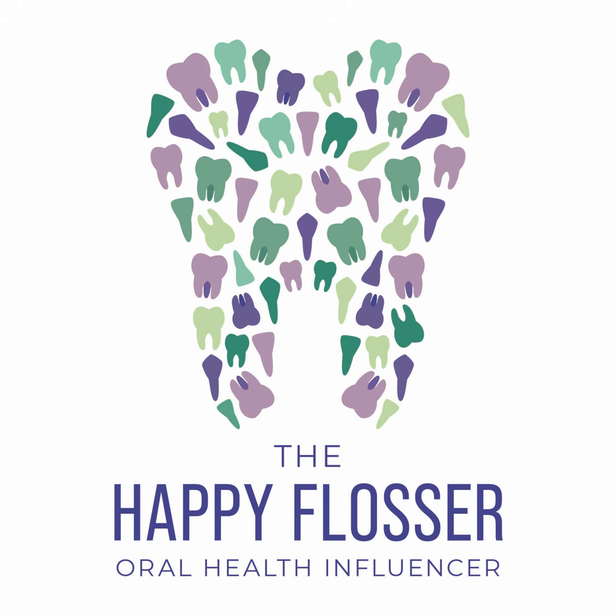Overlap is a diagnostic dilemma for a bite wing radiograph, so you want to keep form and function in mind when you are taking those images. Align the PID so that you are getting in between those areas without having overlap. And if you have challenges with this, work with your faculty so that you can visualize how that rhomboidal maxillary second molar looks on an image when you achieve an open contact there. So you want to make sure that overlap is avoided on those bite wing radiographs especially.